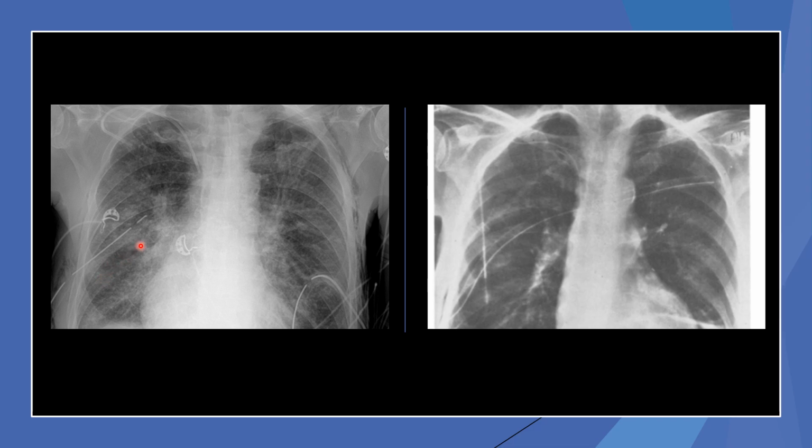But what we're looking at here is you see here's your hole, that break right there in the line, that's a hole for the drainage. But look where the other one is. It's sitting way out here, all right? When it sits out here, we're going to get an air leak, and we're going to end up with subcutaneous emphysema on this patient. We're at high risk for that. I put this in with misplaced chest tubes, and we're going to attribute this one to the doctor, not the nurse. We're going to say he just didn't put it in high enough.